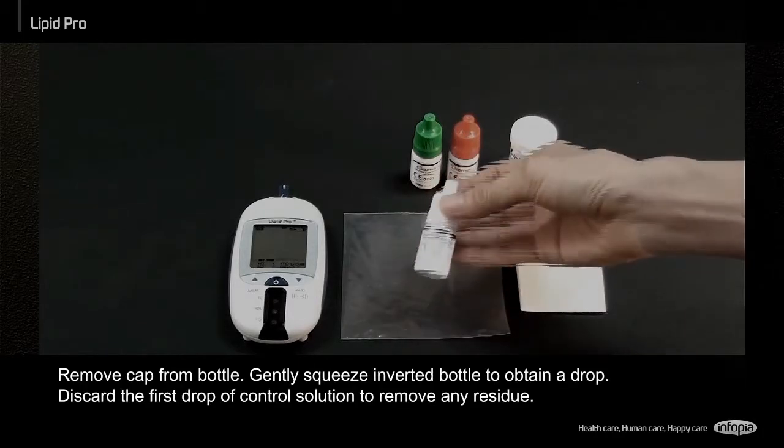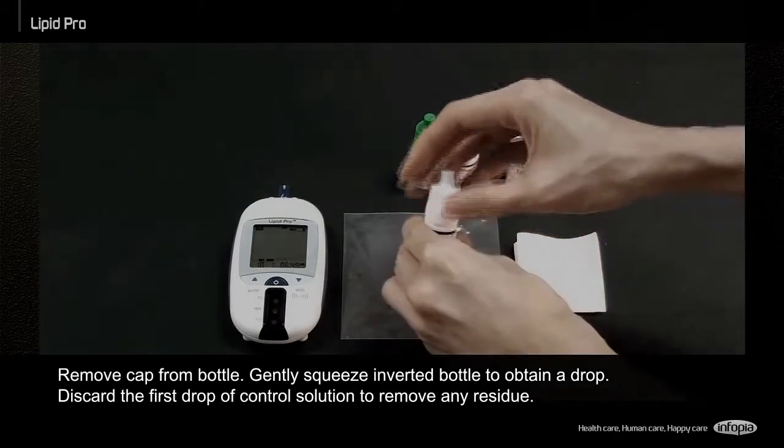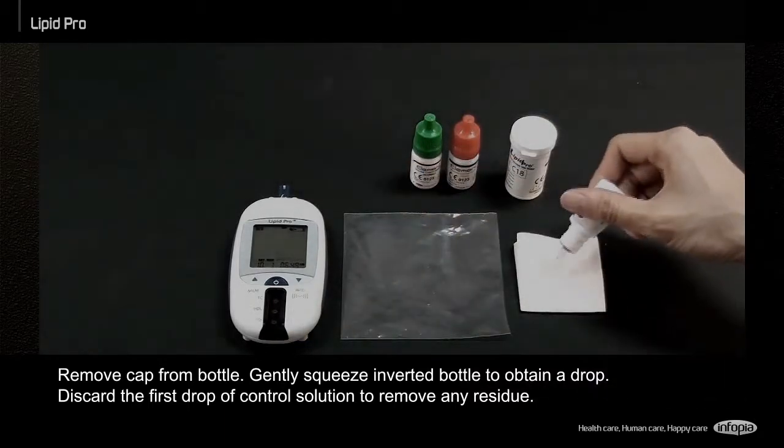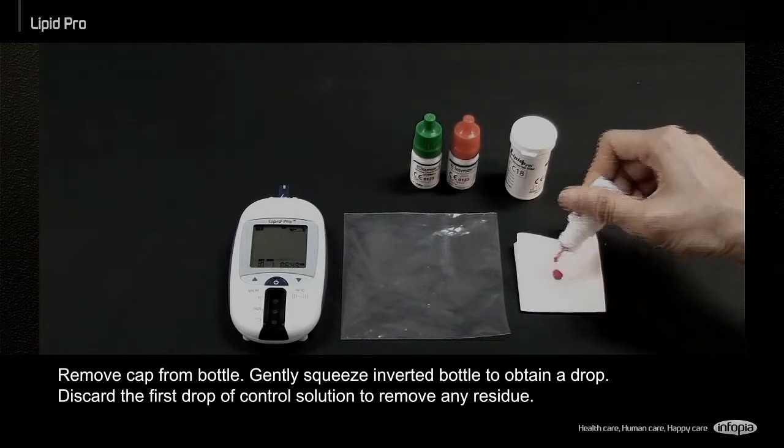Remove cap from bottle. Gently squeeze the inverted bottle to obtain a drop. Discard the first drop of control solution to remove any residue.